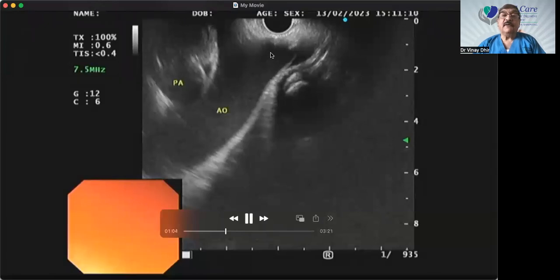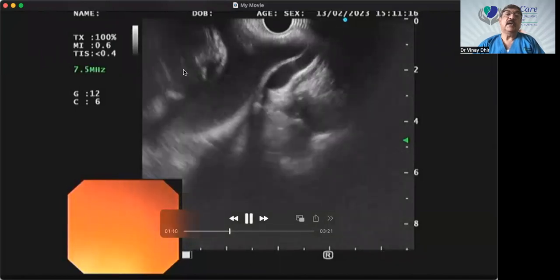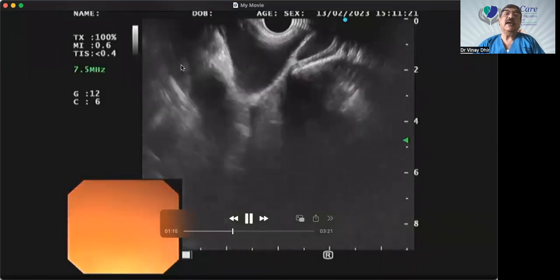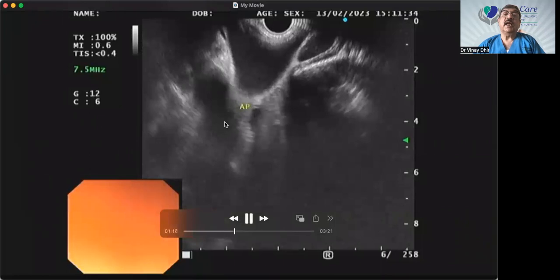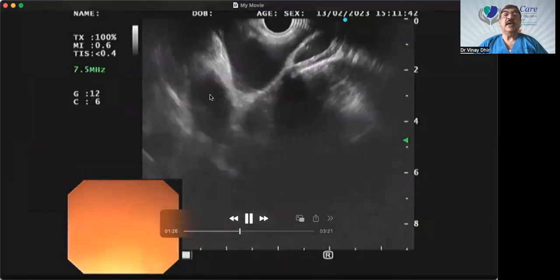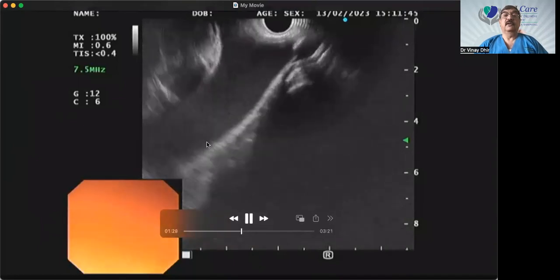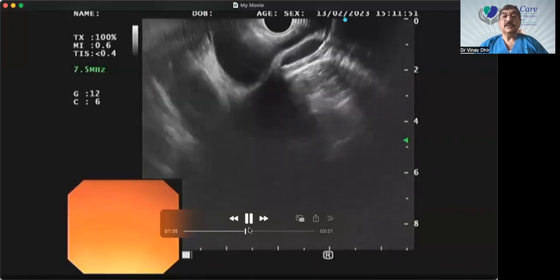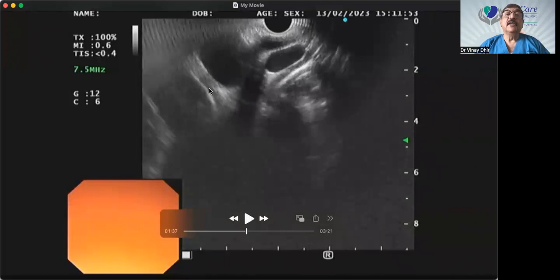At the same time, turning the scope a little clockwise, you see the complete arch of aorta. Underneath that is this big vessel which is the left pulmonary artery. The left pulmonary artery crosses anterior to the arch of aorta — see this? This is the AP window. It's a beautiful view of the AP window, better than most traditional views. This is the actual window which we don't see in the traditional view so well.